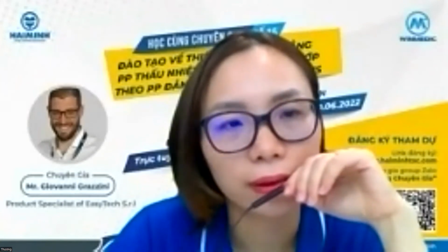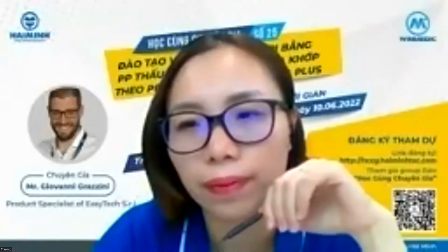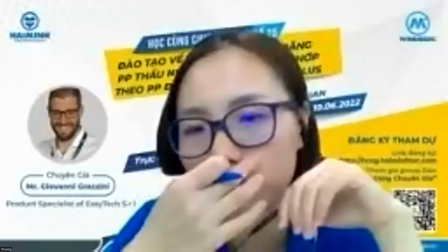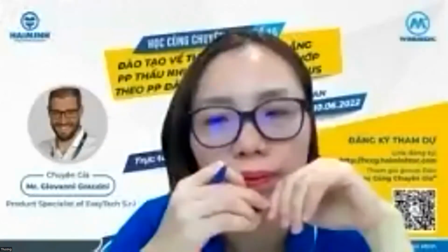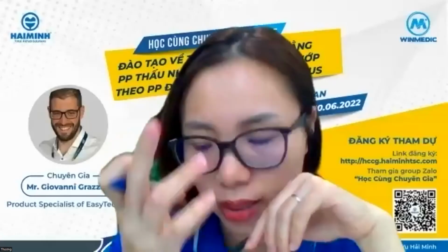But then there is the good sense of the person, so you have to pay attention. Just read and go through the contraindications. The standard ones are currently the same for any kind of device.